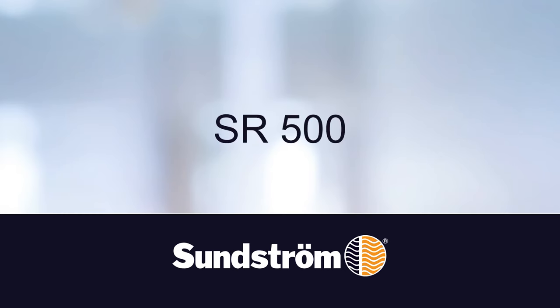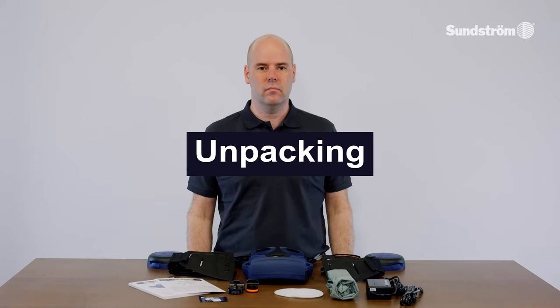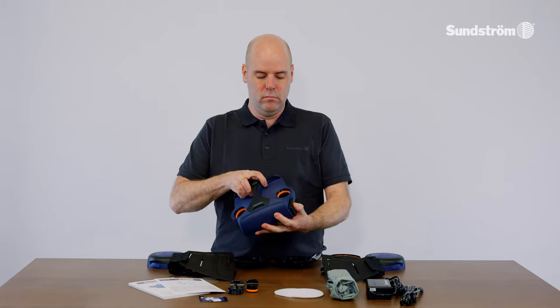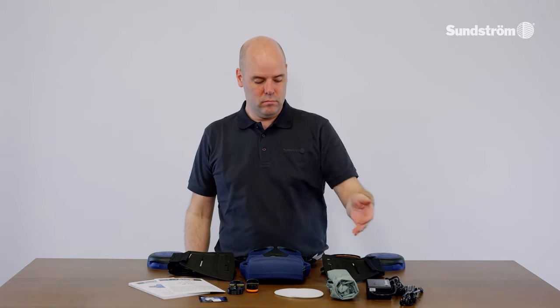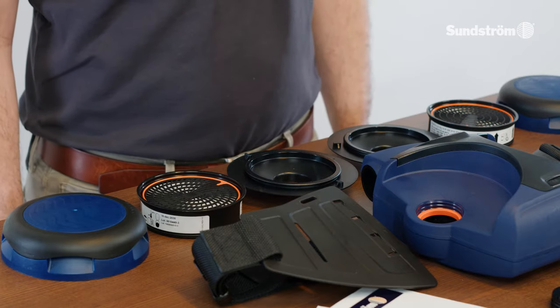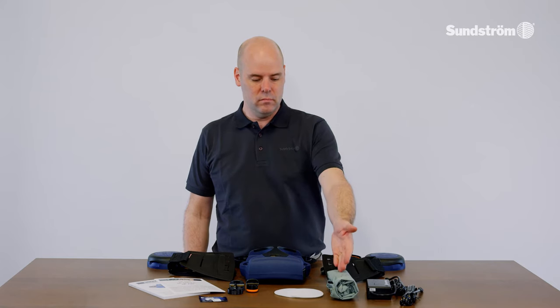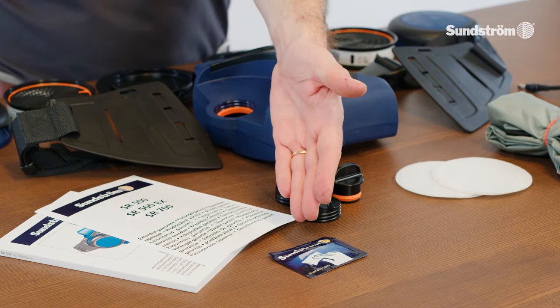SR500. Unpacking the SR500. Check that the packaging contains: fan unit, SR500 battery, battery charger, belt, particle filter SR510 P3R, filter adapters, pre-filters, SR221 pre-filter holders, flow meter, user instructions, plug kit, cleaning tissue.